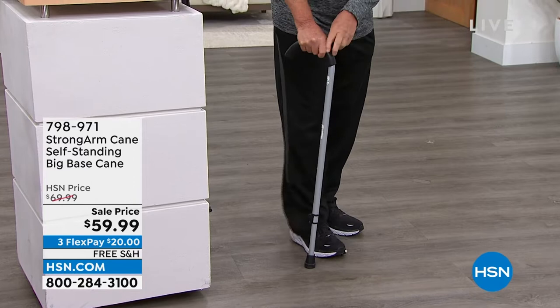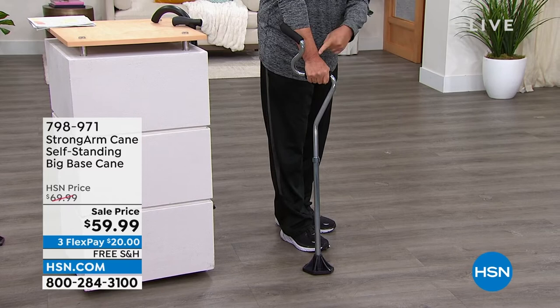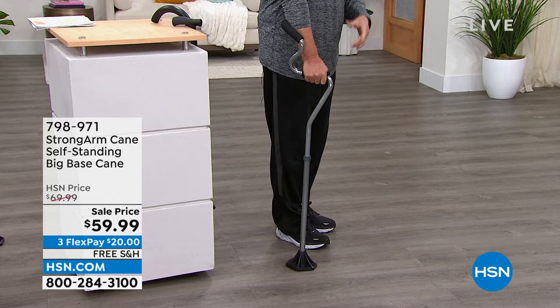Let me switch it out and show you the comfort cane. What's going to happen is it's going to give you the balance and the stability — you're grabbing it right here, but all of that pressure is shifting from the wrist to the forearm. Notice the forearm is resting in that cushioned cradle, which adds to the comfort as well. That is the major difference with the comfort cane.